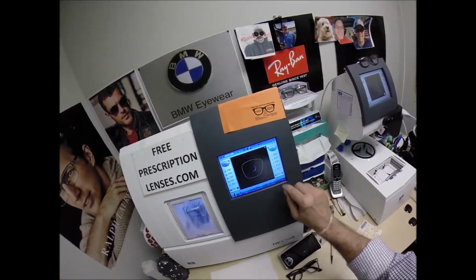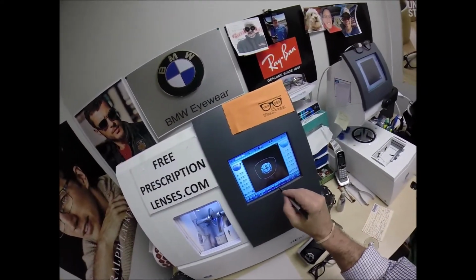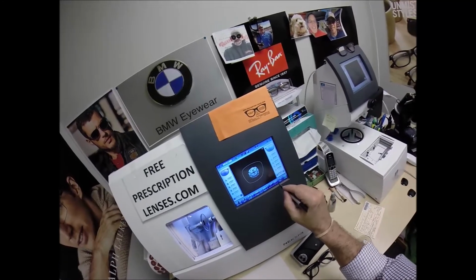Of course, I like to call it the Charles because I don't know this machine well enough to call it Chuck. Hit the green arrow. Actually, hang on. Let me do some things here. I'm going to move the bevel back on here. Let me cut this on the manual cycle.